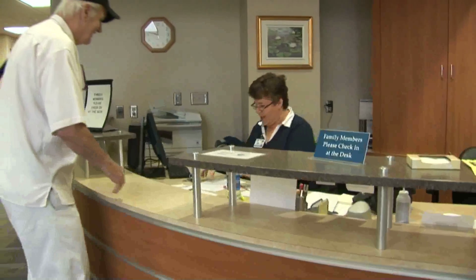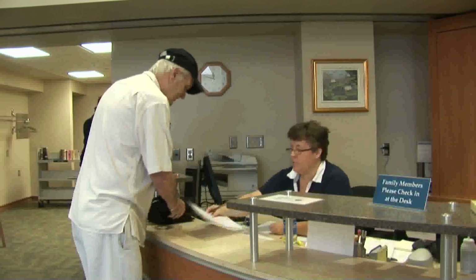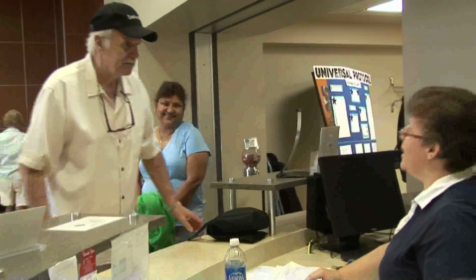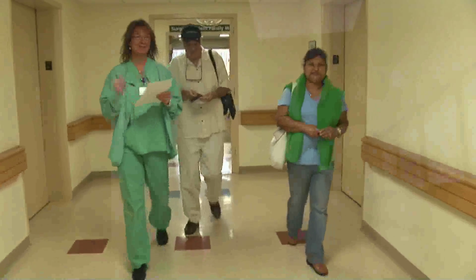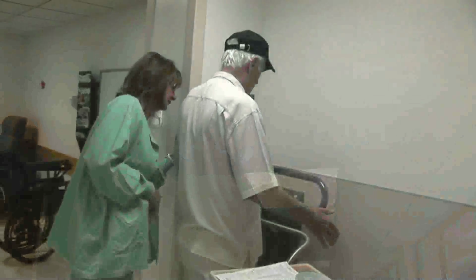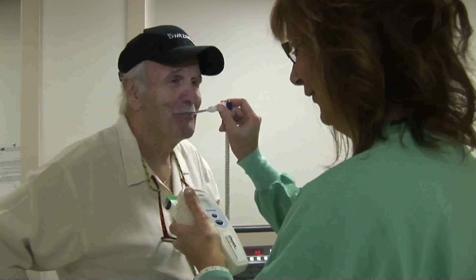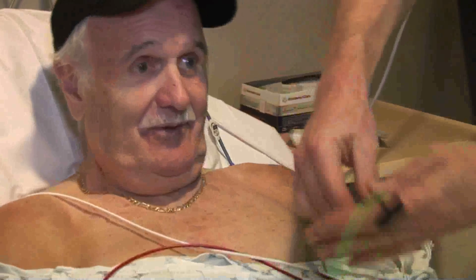For outpatient procedures, the patient checks in upon arrival. After all the paperwork is done, the patient is greeted by a staff from the invasive cardiac lab and taken to the holding area where preparations are made for the procedure. This includes obtaining vital signs, placing an IV, possibly drawing blood, and hooking the patient to a monitor.